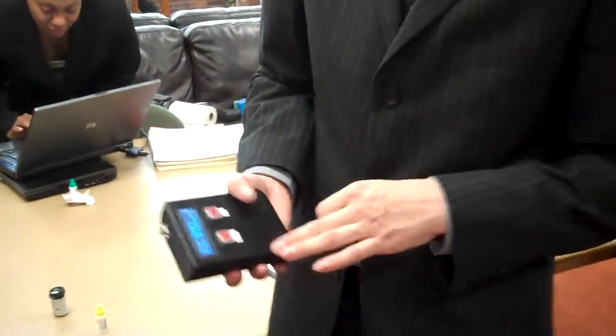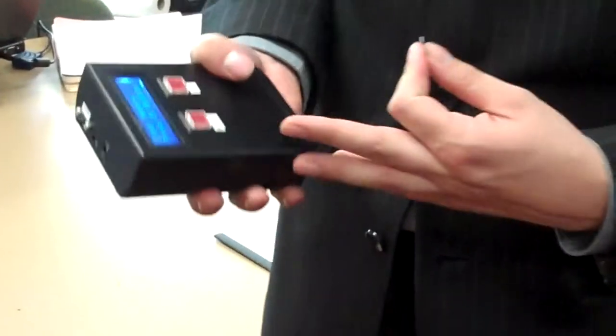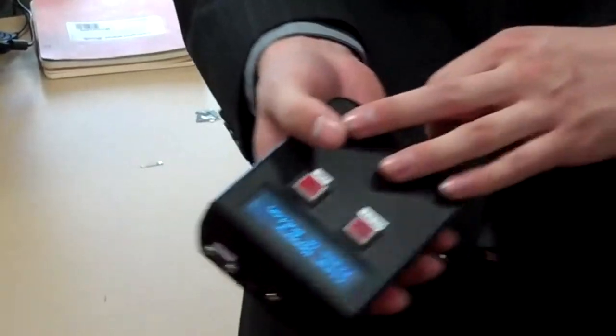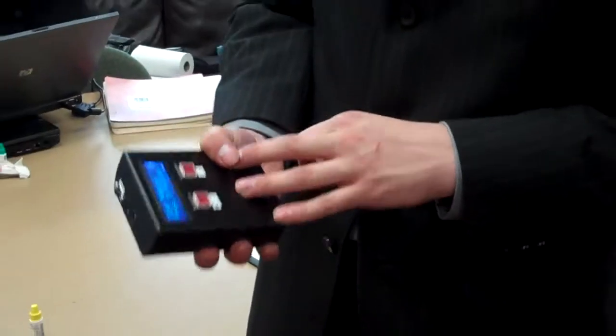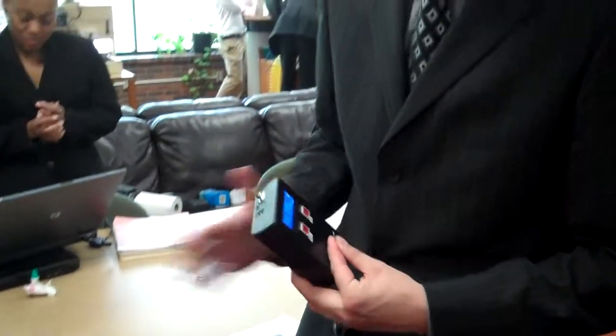We took the circuitry for a glucose meter, built it from the ground up, and made it so we could have memory. It'll store your readings for up to three months and wirelessly transmit into a computer program where you can have data management. You can look at graphs, trends, highs and lows.